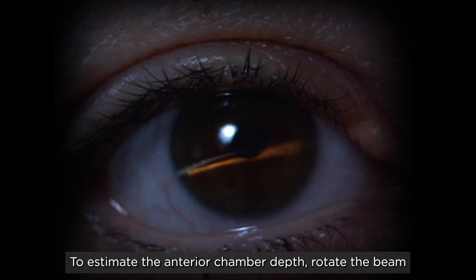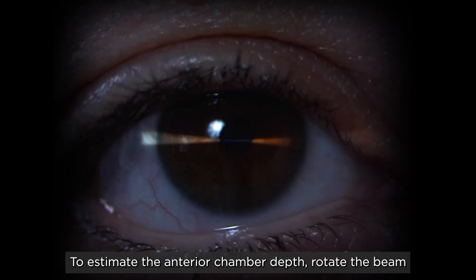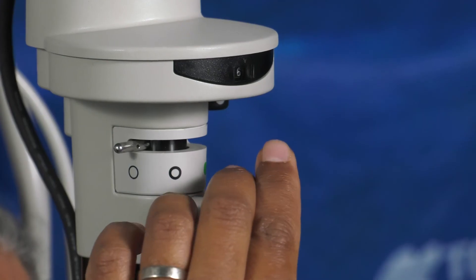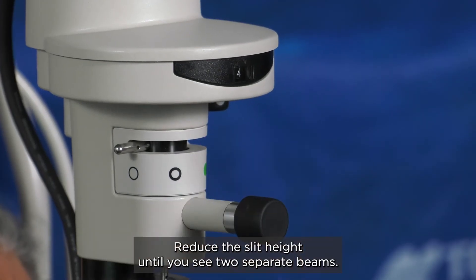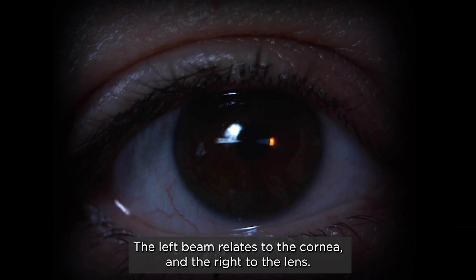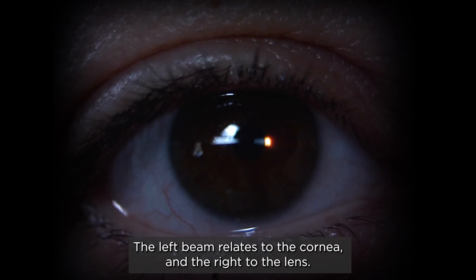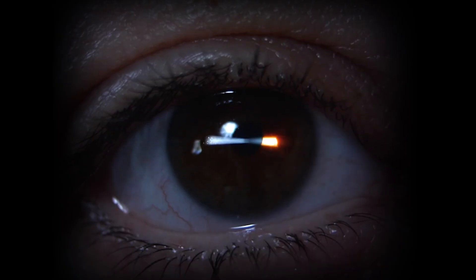To estimate the anterior chamber depth, rotate the beam horizontally and recenter it over the central cornea. Reduce the slit height until you see two separate beams. The left beam relates to the cornea and the right to the lens.